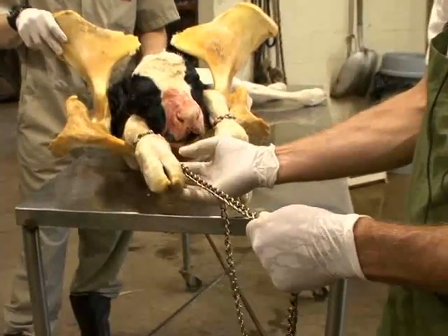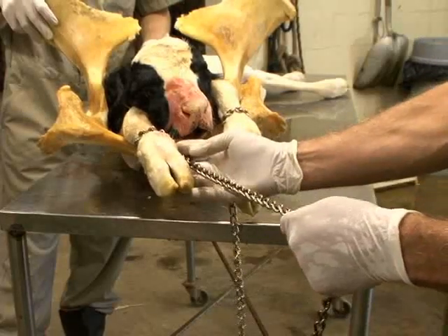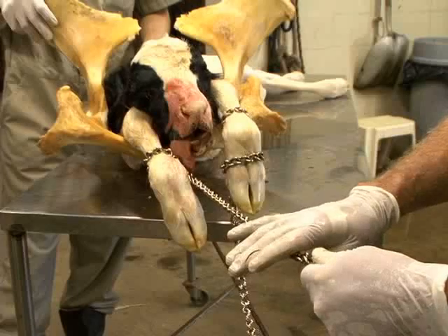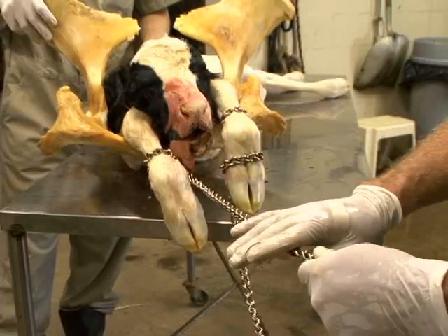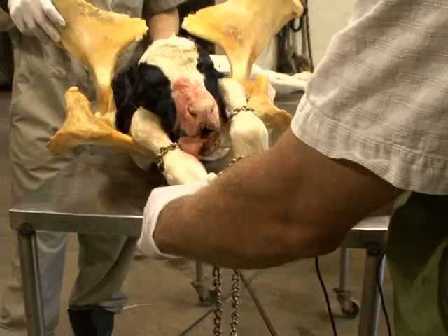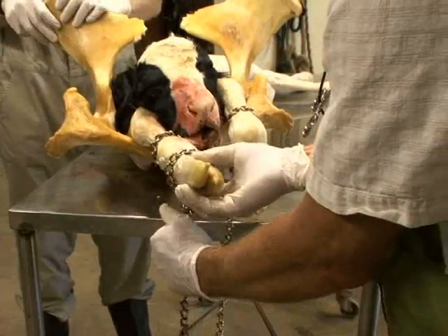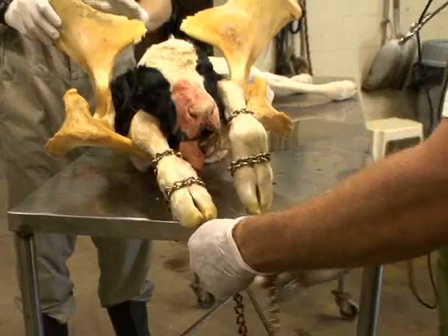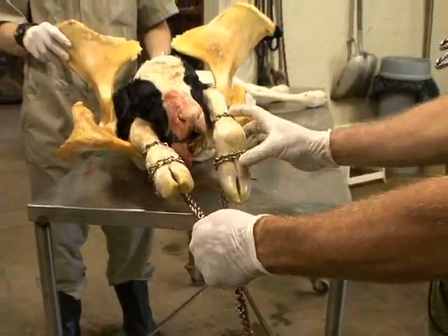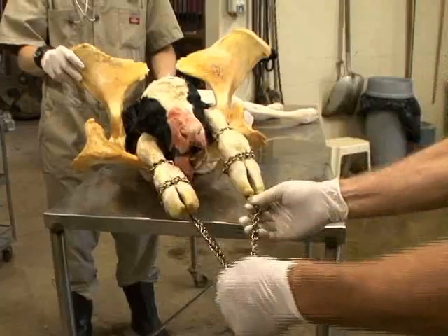Again, make sure not to put a tremendous amount of force on just one chain loop on the leg, because that can cause damage and possibly break the metacarpal bone. So again, apply a second loop by placing your hand flat on the extended chain out of the vulva and making a simple fold to create a second loop, which you apply just distal to the fetlock. Slide it down and cinch it snug. With one long chain you can correctly apply OB chains to both limbs, avoiding injury to the calf and allowing the person delivering the calf to apply the force needed to remove the calf during parturition.